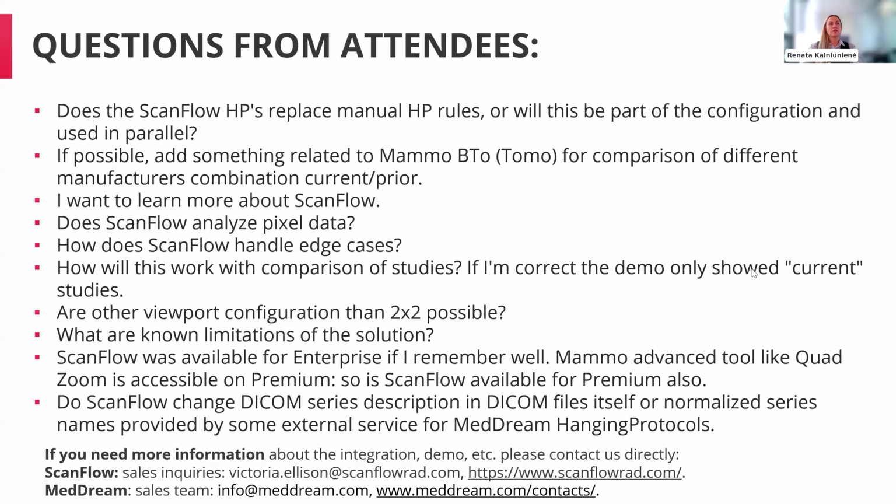Okay, thanks. I'm reading the next one. Are other viewport configurations than 2x2 possible? 100%. We can do whatever configuration the radiologist wants. The reason we just kept it 2x2 is to keep it standard and consistent, because a lot of radiologists like reading in this 2x2 configuration. But yes, the configuration is irrelevant for ScanFlow. We can make it whatever configuration you want. The main reason that these hanging protocols break is inconsistent DICOM metadata. So whatever configuration you want, ScanFlow can easily make that possible.